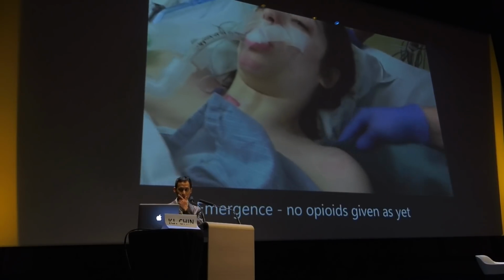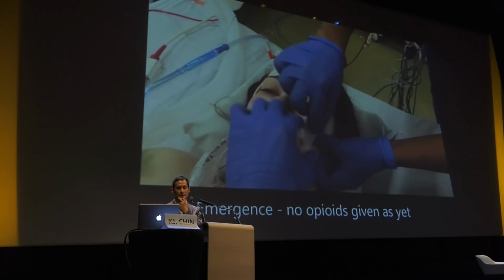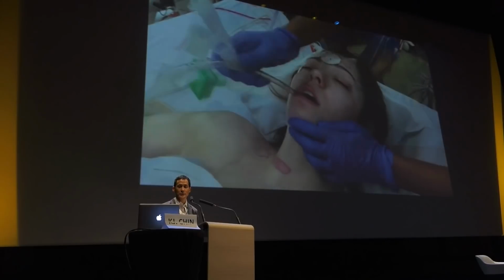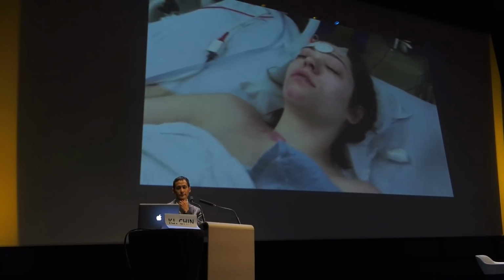Your surgery's all done. Good. So just open your mouth for us. We're going to take this tube out. Nice deep breath. So this is emergence. We still haven't given any opioids up to this point. Right. Well done. You came through this really well.